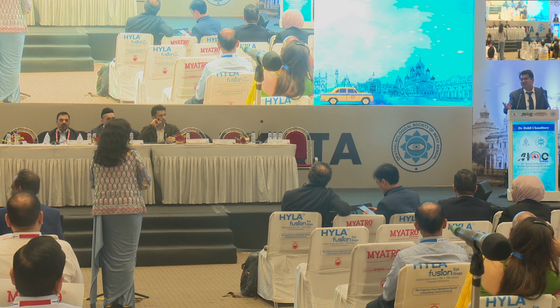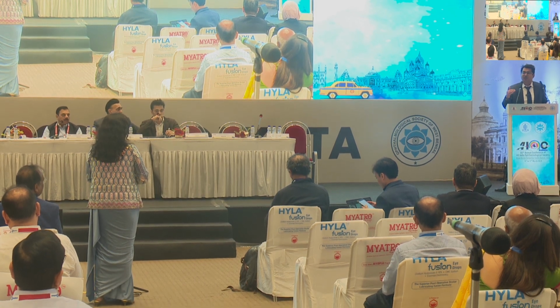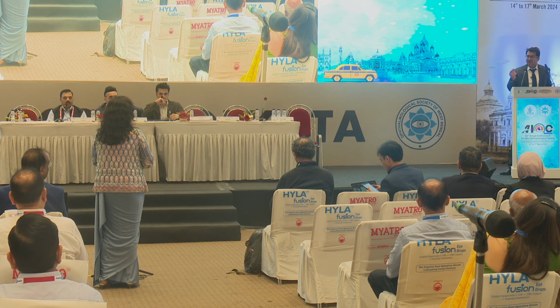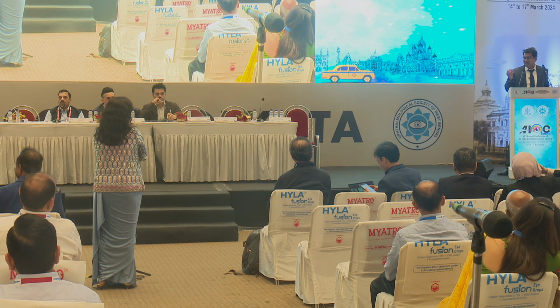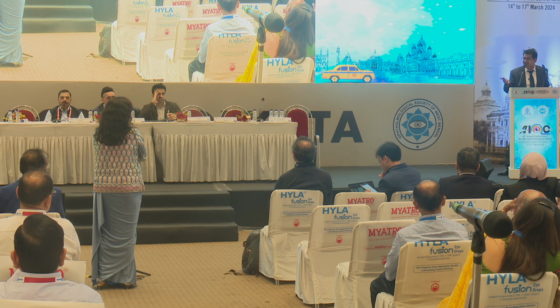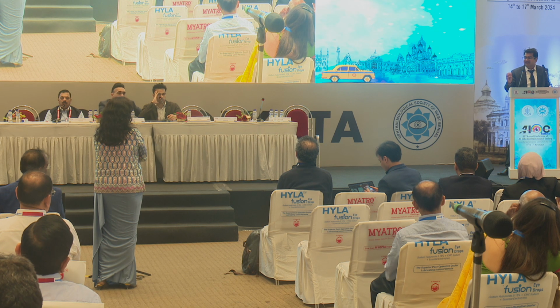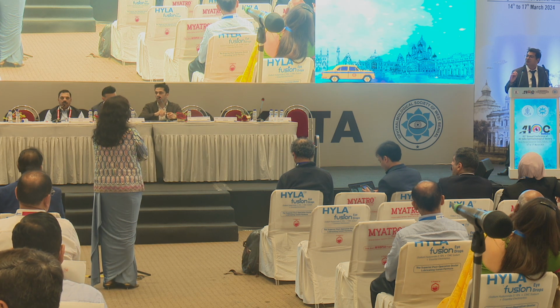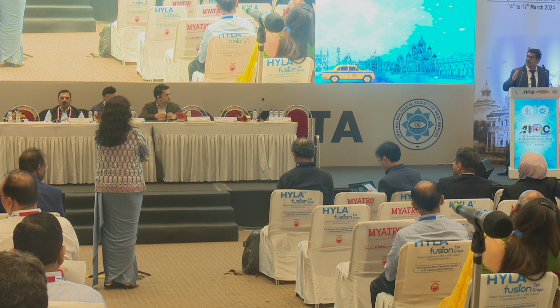Yes. So initially, Contura has been approved for virgin eyes, normal corneas with minimal irregularities. And the idea was that when you correct these irregularities, you are able to give a visual excellence advantage to the patients. But over time, doing so many Conturas over the years, what we've realized is that only 5 or maximum 10% would really get that supervision advantage. For other patients, the results are comparable to wavefront optimized.